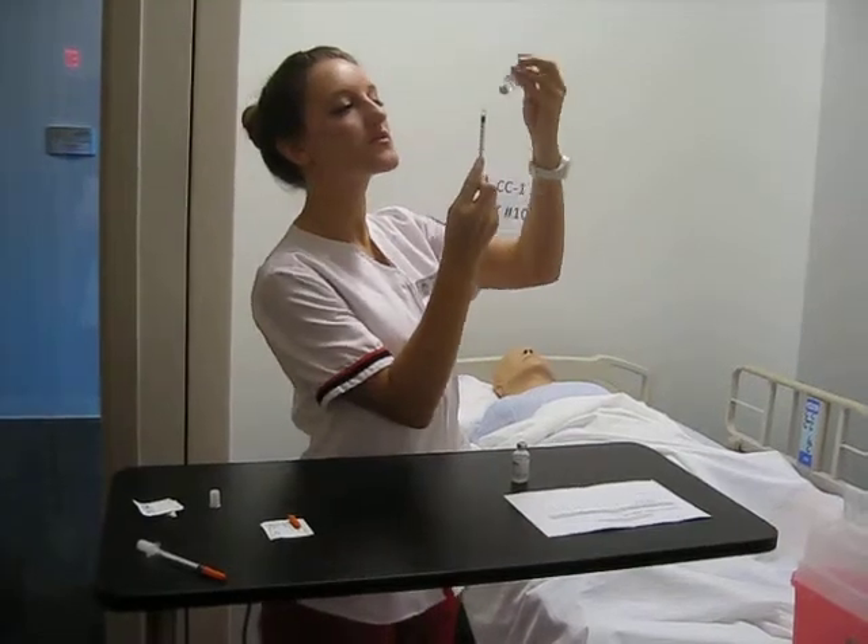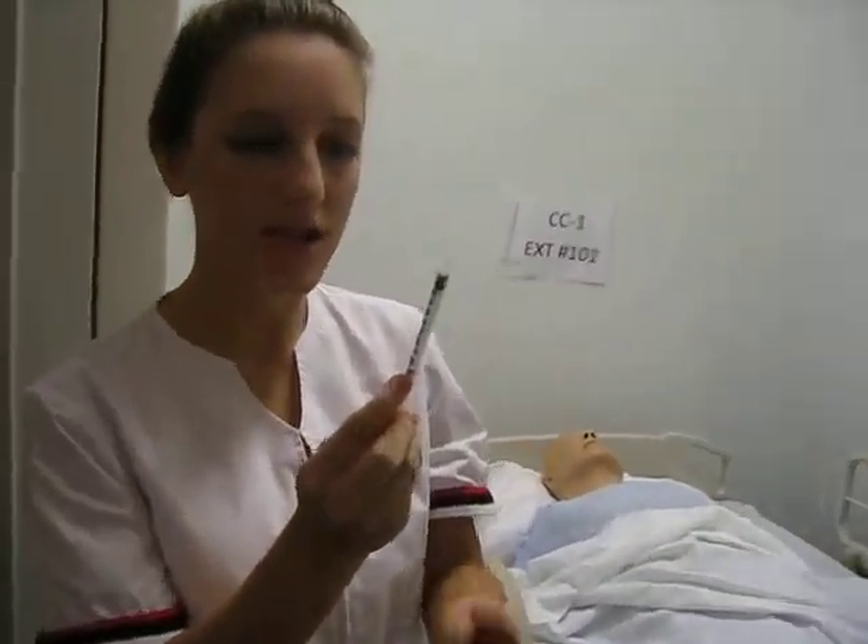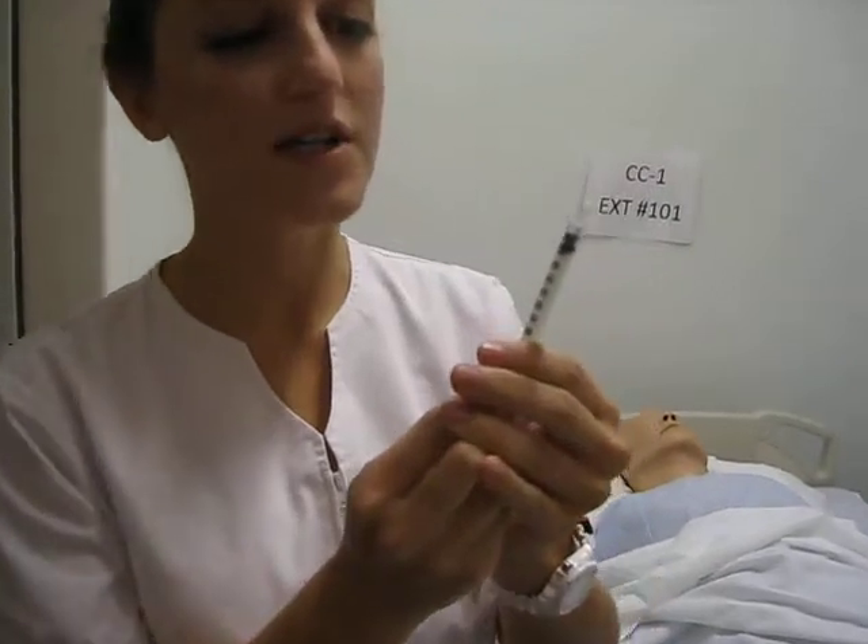I'm going to check for air bubbles, and I would need to check this with a registered nurse.